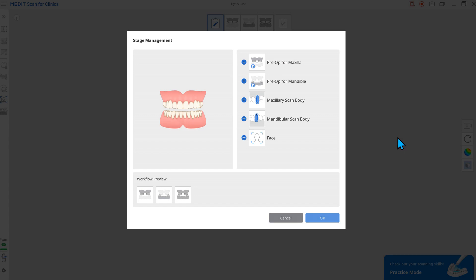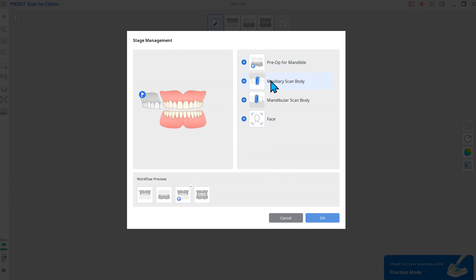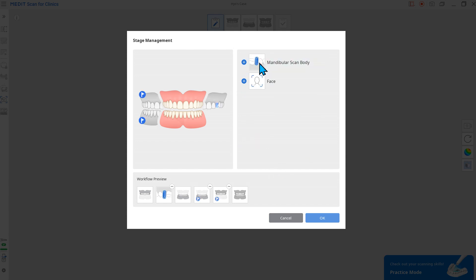All available scan stages are listed on the right. With just a single click, you can add pre-op stages, scan body stages, or face scan stage.